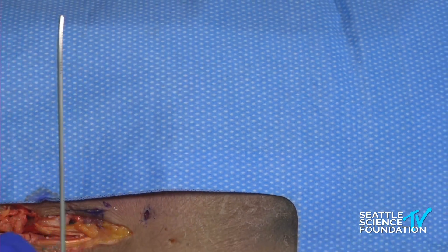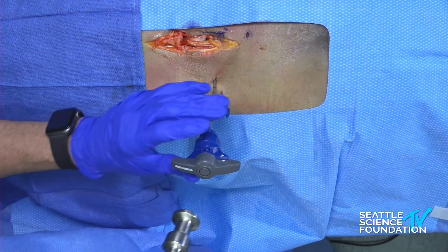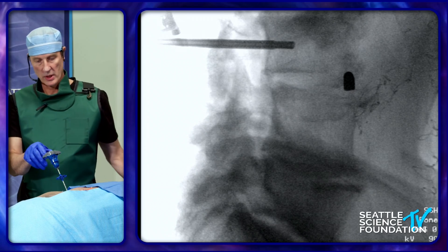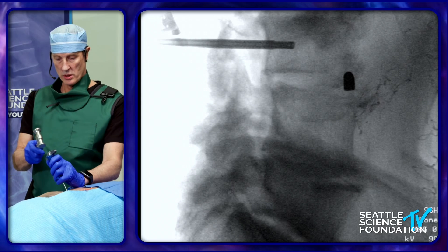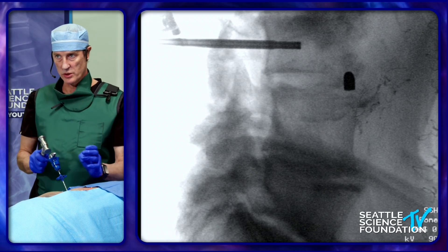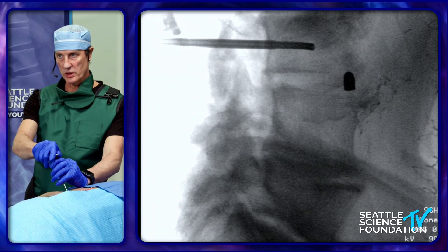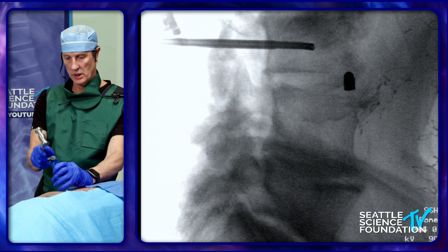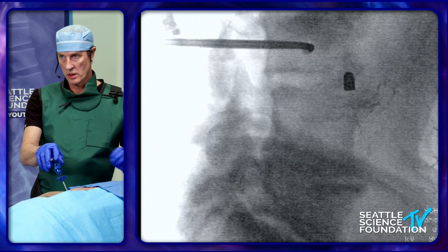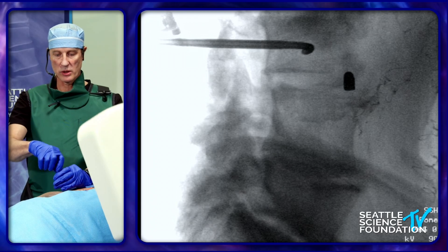So I'm going to straighten it back out and place it back in the cannula. We're going to tap it into the vertebral body just a little bit, and once we get it in, I'm going to start putting it under a little bit of steering pressure — I'm going to turn it clockwise. You can hear this vertebral body is incredibly hard on the inside; it has some of that discogenic sclerosis. We're going to get it out toward the anterior portion — you can see it's starting to foreshorten a little bit, starting to turn back toward us. We'll stop at that position. Let's come around and take an AP shot to see where we are.